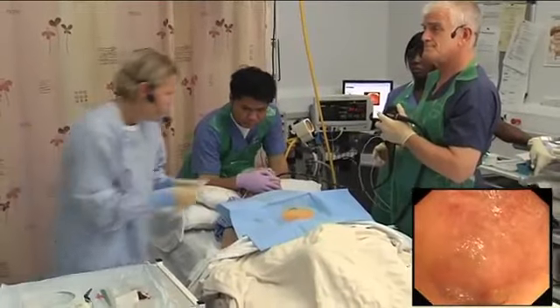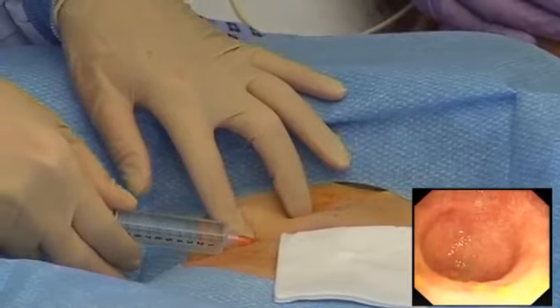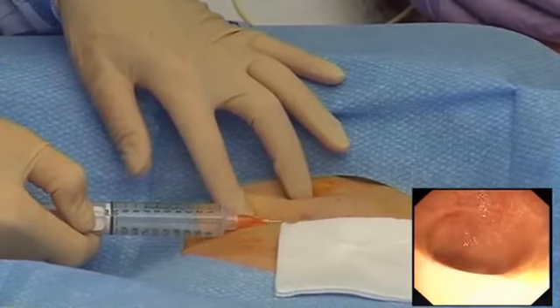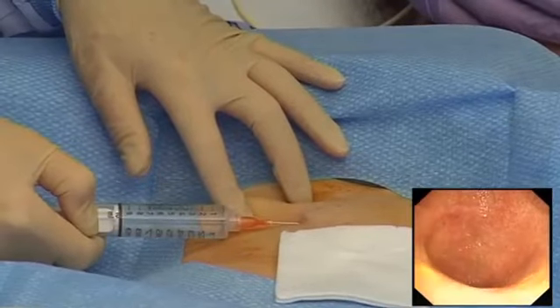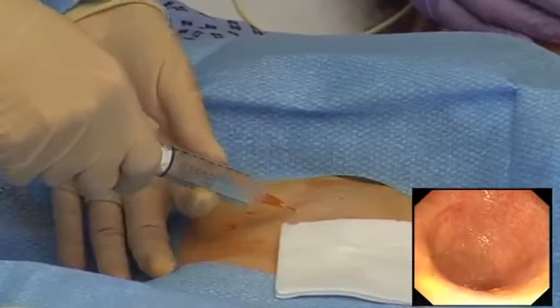So I'm just going to inject the area with local anaesthetic. It's important to keep the stomach fairly well inflated, so that it's blown up against the anterior abdominal wall. Just aspirating as I go.